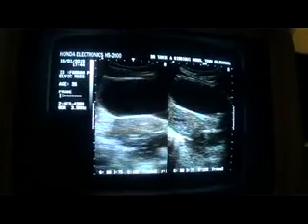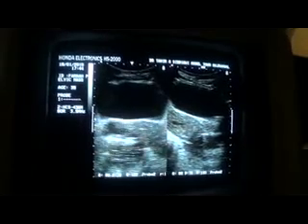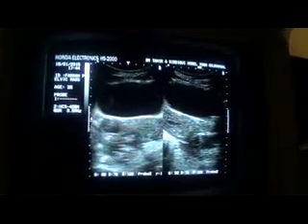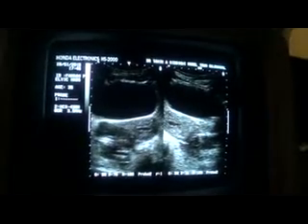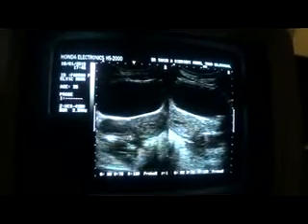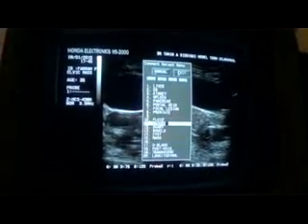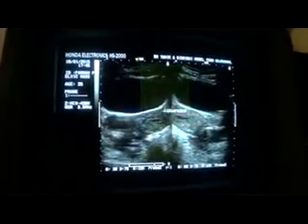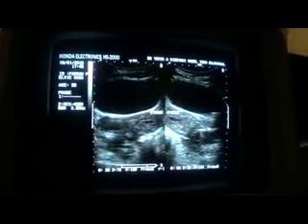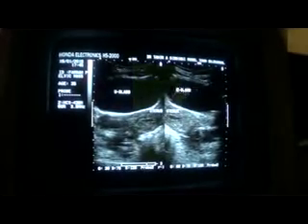Okay, now from any other angle, let's see the transverse section. Again, there is an impression of some breach over there, so that I will figure out that there is some history. There is something fishy that the patient is not revealing, and it appears to be manipulation as a cause of the collection in the pelvic cavity that is extending up to the right lower abdominal quadrant.